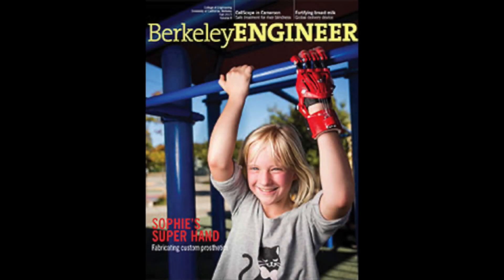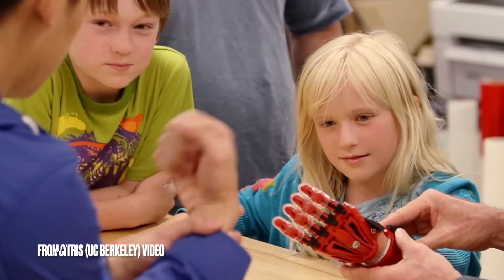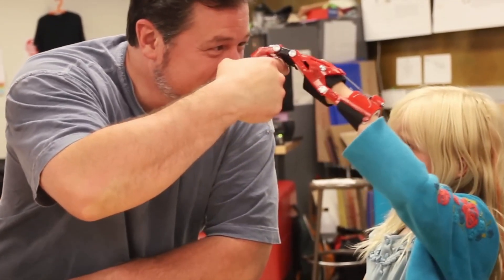Many years ago, I had the opportunity to volunteer in building a 3D printed prosthetic hand for a child with hand deformity using an open source design. Witnessing the joy it brought was truly inspiring.